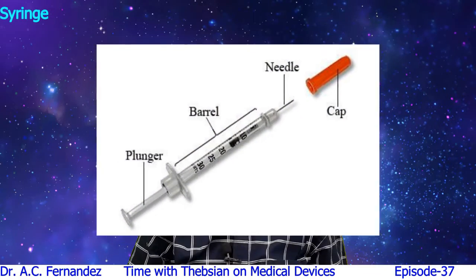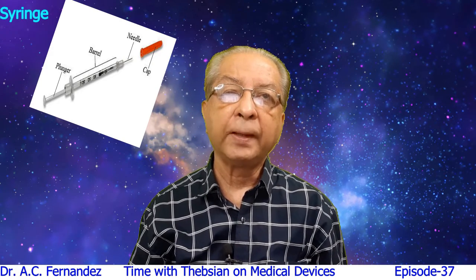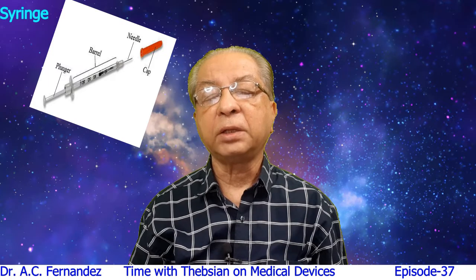Syringes are a very common thing to everybody. Everybody knows about syringes. Syringes are a very common thing maybe in every house because the uses of syringes are varied. Usually a conventional syringe or a regular syringe is made of glass or plastic, and they may come attached with a needle or simply as syringes only.